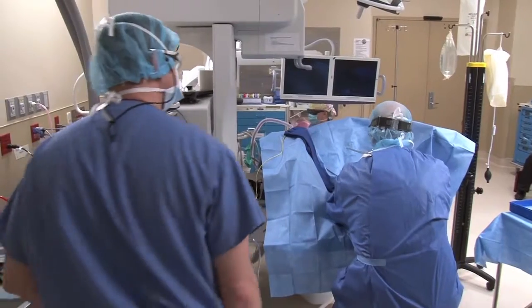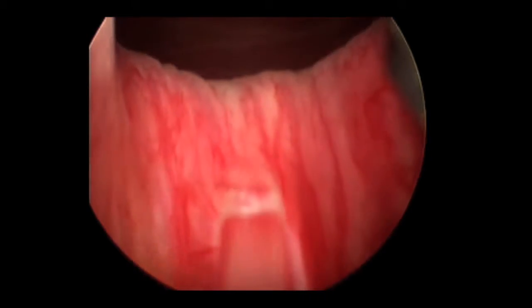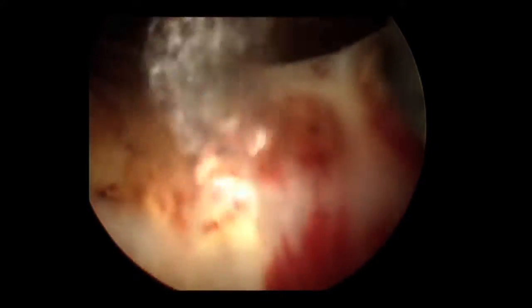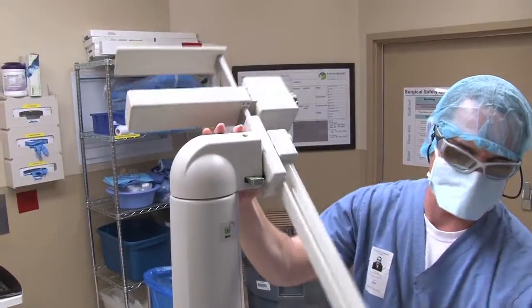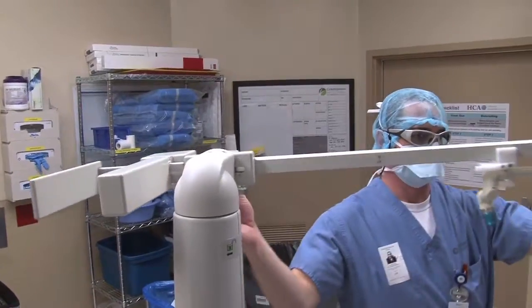Monitor the laser's optical devices during a case to ensure they remain in good working condition throughout the procedure. If using a laser with an articulated arm, keep the arm stowed until the physician is ready to use the device.